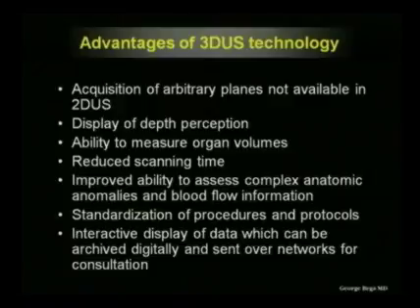It can be compressed for file size. It can be encrypted for security, and it can be sent over networks for consultation with the best pediatric cardiologists in town, in the country, or in the world. Obviously, the HIPAA and security of the patient information aspects would have to be considered. But otherwise, this is a great way to do teleconferencing or provide expert analysis of patient information at remote areas.